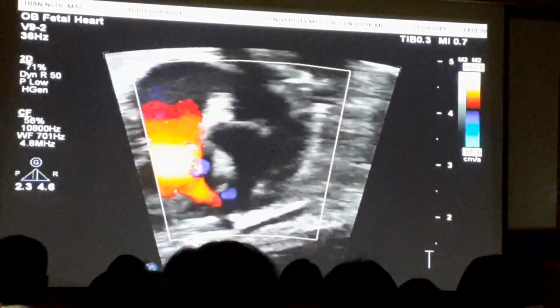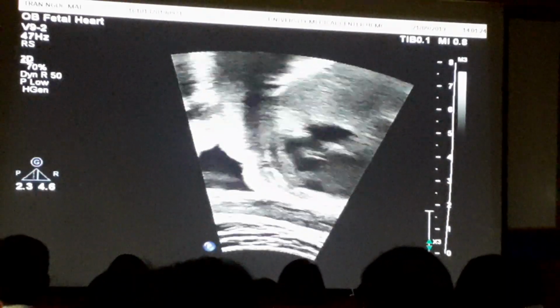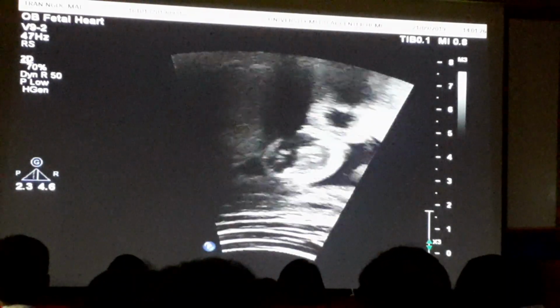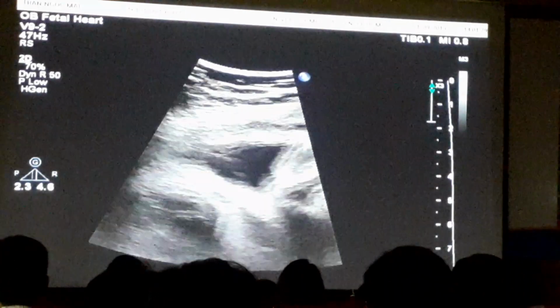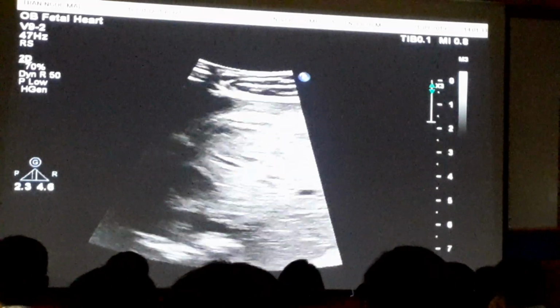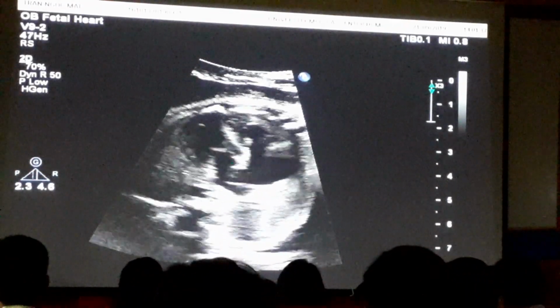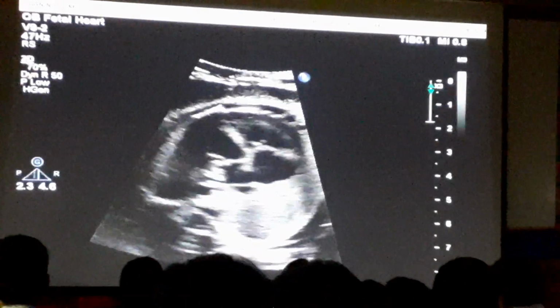Và như vậy bây giờ trong bụng mẹ thì cái kháng lực phổi sinh lý nó sẽ cao, cho nên áp lực phổi nó cao, do vậy nó sẽ làm cái hở van ba lá này nó nặng. Nhưng mà hy vọng sau khi bé sinh ra, với cái sự tiếp xúc của oxy, cái mạch máu phổi nó giãn ra, cái kháng lực nó giảm xuống thì cái hậu tải của thất phải nó sẽ giảm xuống, và do vậy cái hở ba lá nó sẽ giảm đi rất là nhiều.